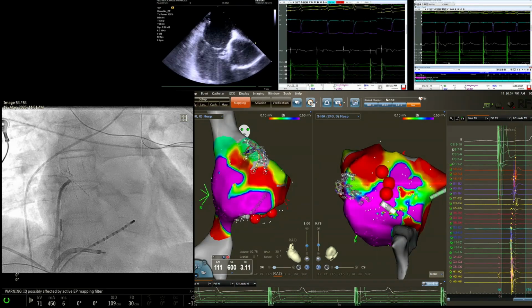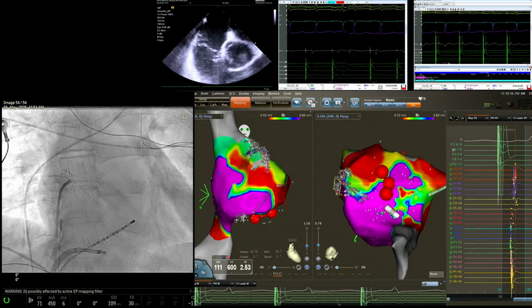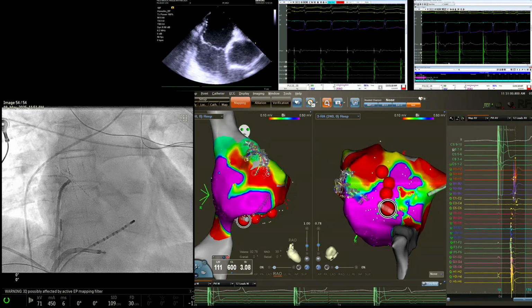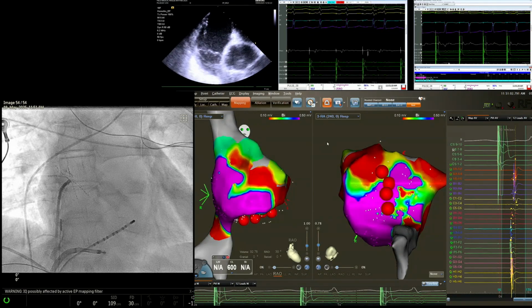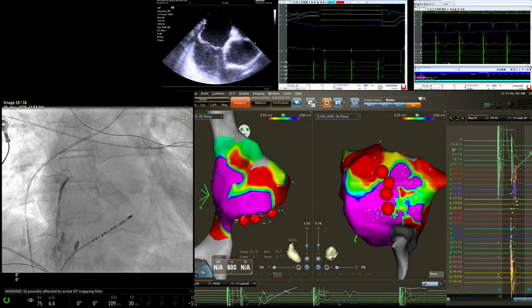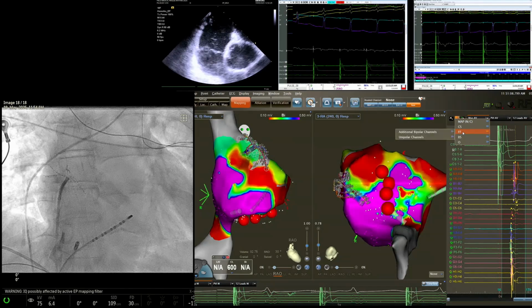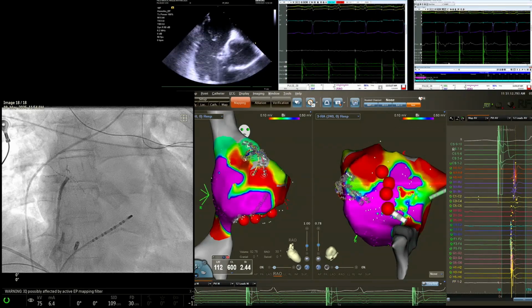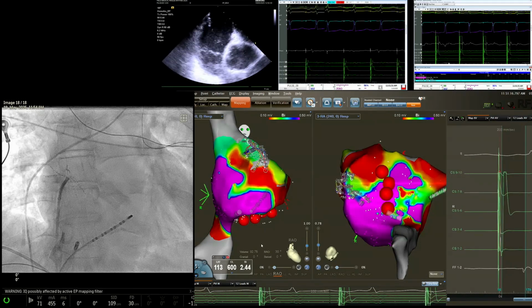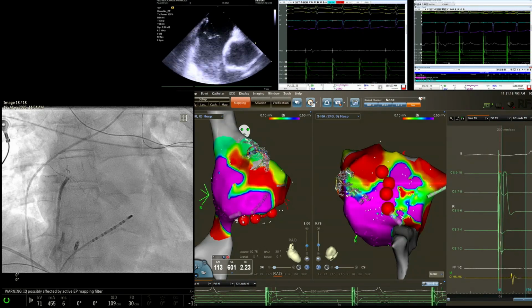No, not at all. The way the field works, you actually don't need to be directional at all. In fact, when you're parallel to the tissue like we are right now, it actually ends up being very, very effective. In contact? Here, no, I don't like my contact now.